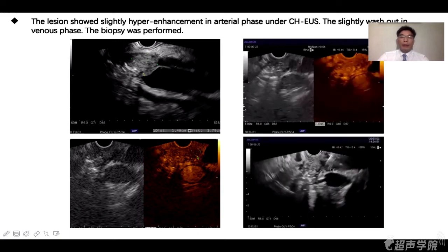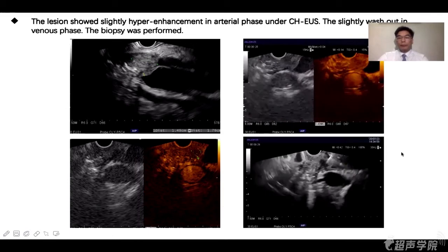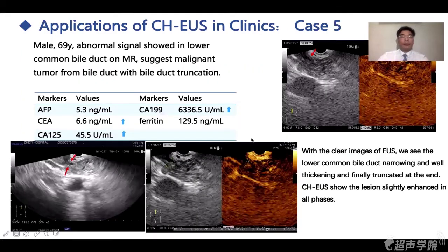The biopsy was performed. With cytology examination, cancer cells were found and proven by the operation specimen pathology.